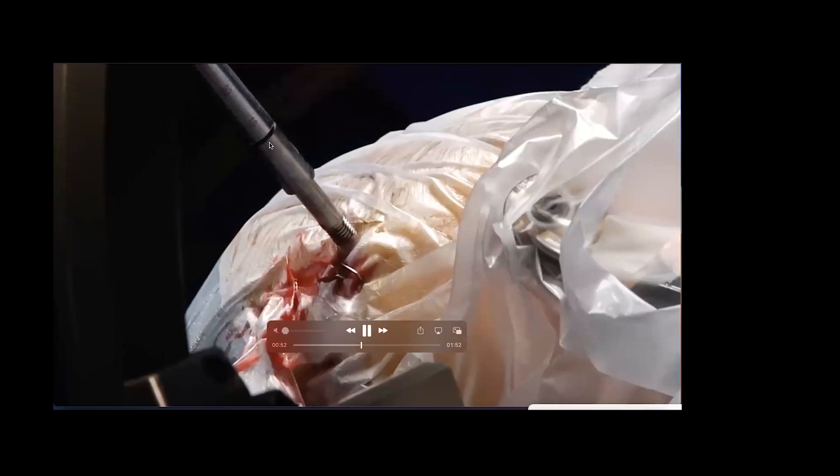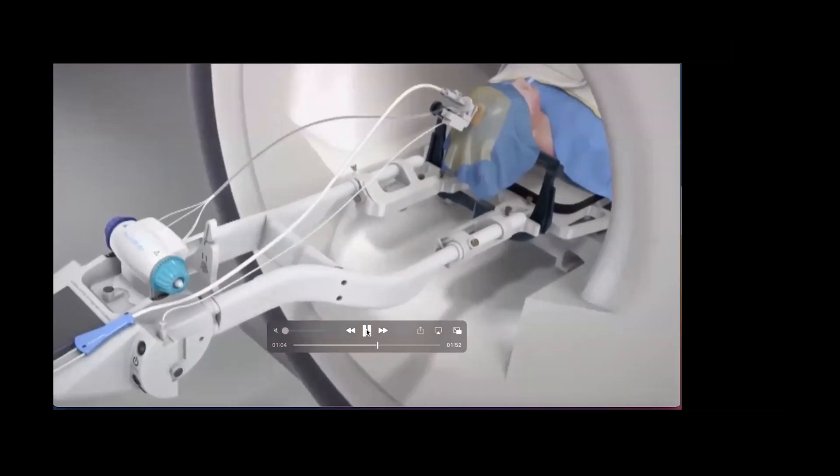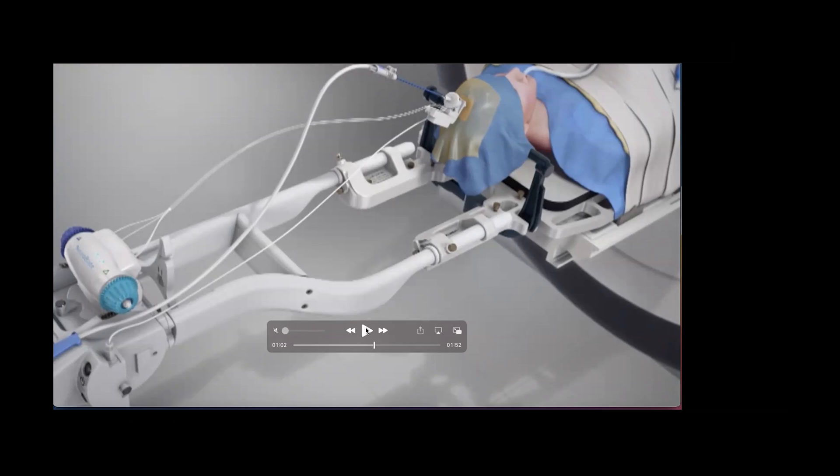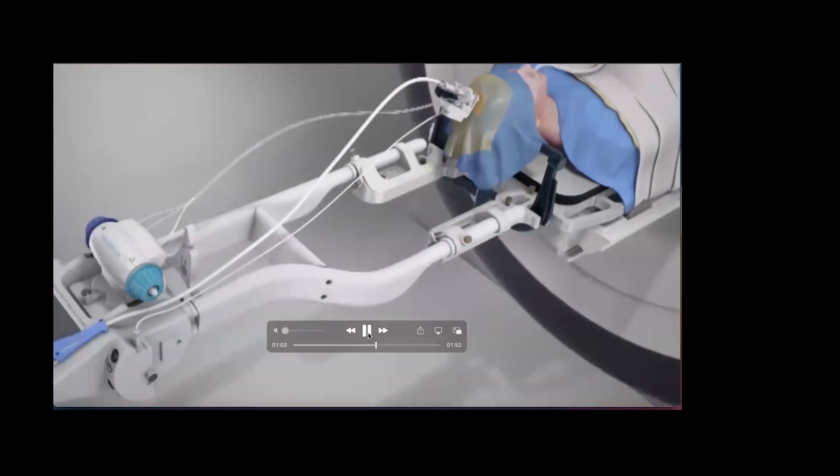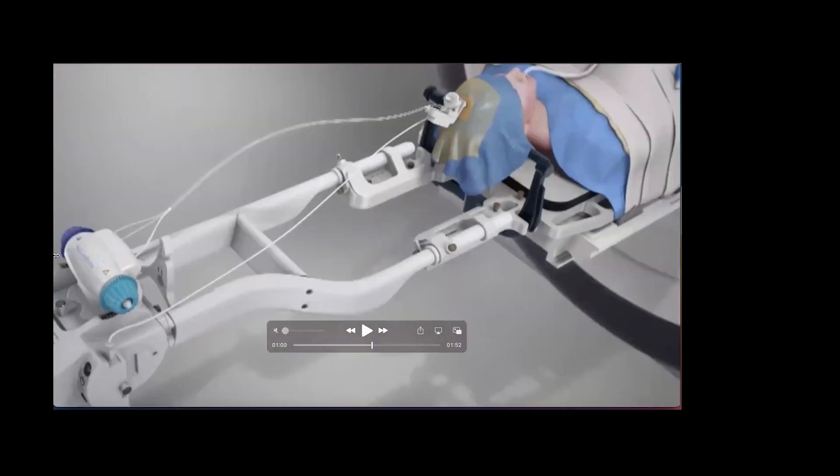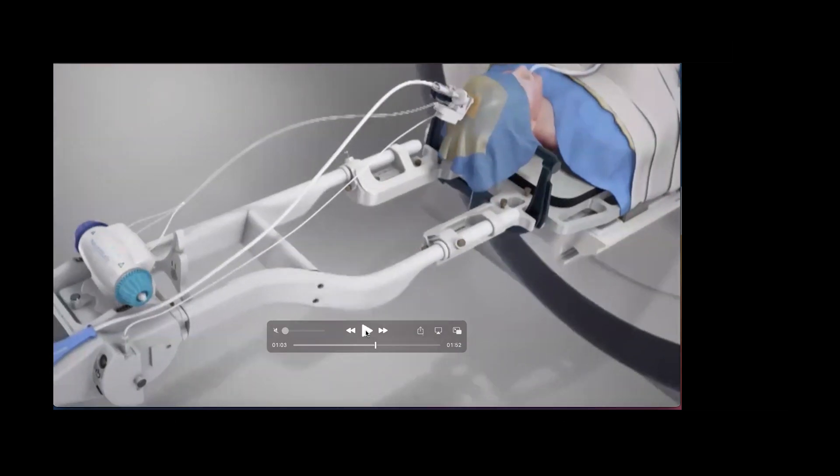Here we are, once we've drilled our pinhole into the skull and perforated the dura we enter the bolt. Once the bolt is placed stereotactically, the next step is to place the laser probe. This is what you'll see here. We have an intraop MRI now. The MR is brought into the OR, but in many centers the patient is brought from the OR to an MR suite, which can be on another floor. The laser probe is inserted in the target. What's controlling the movement of that probe? This is the Monteris system of the two systems. This system, what you're seeing here is the robotic arm. Brandon likes robots. There's all the things. If you're into sci-fi, this is the surgery for you. You actually manually insert the probe through the bolt with very precise calculations obviously in terms of the length to place it in. The system is well equipped to be accurate in that sense. But once it's manually placed in the target, you can advance it or withdraw it with the robot, with the system that I'm showing here in Monteris.